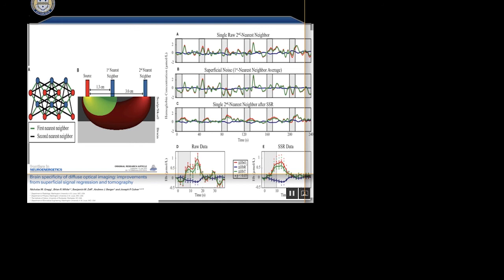That was important because your system can actually saturate. We had to split it up, because if we try a single detector measurement this close with the source-detector pairings on the fNIRS board, you would just have saturated signal. That's a problem. This has a much lower dynamic range. The sensitivity is at the same level at the high end, but when you get down, this one will not saturate. That one will.